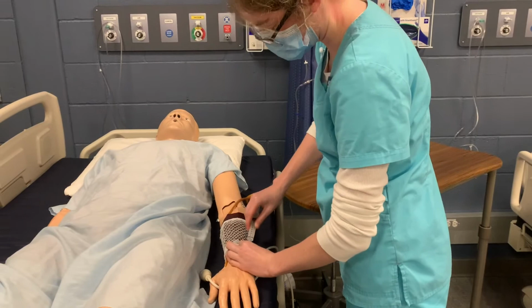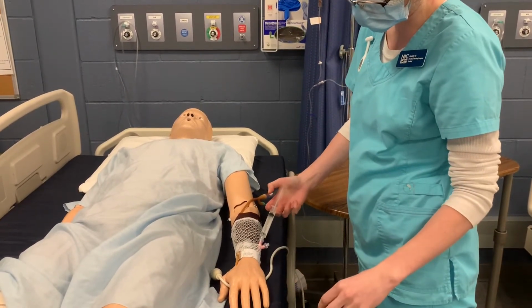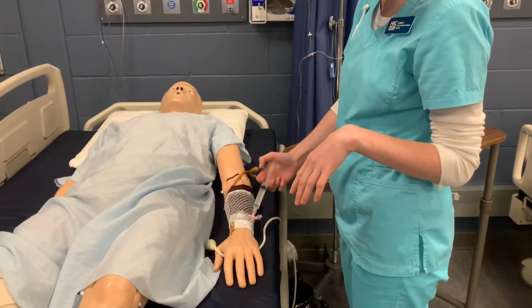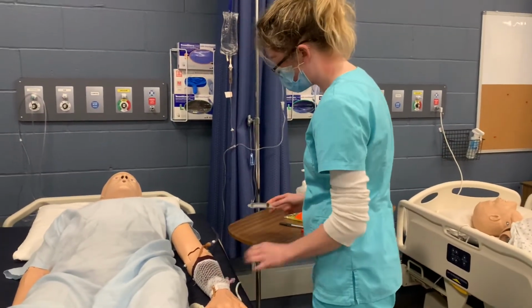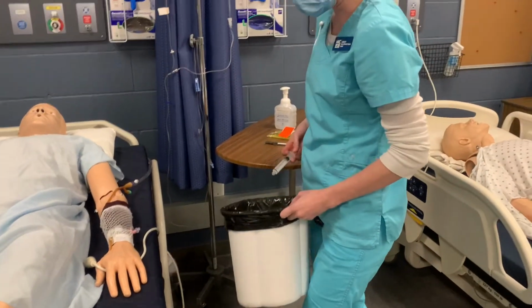I'm going to screw it on and do a flushing motion of quick 2 milliliter flushes, but because this is a doll, it's not going to work. But we'll just pretend that it did. And I can actually show you in a garbage bag what I would do.